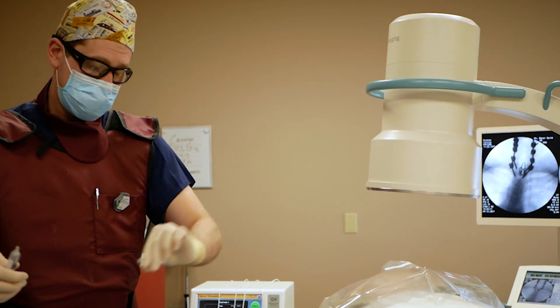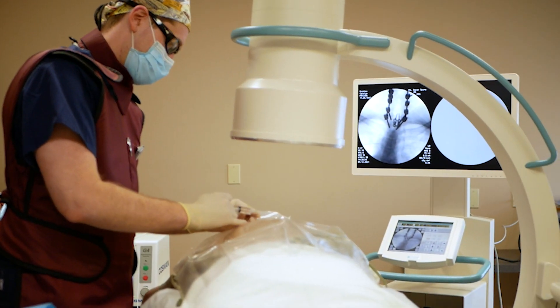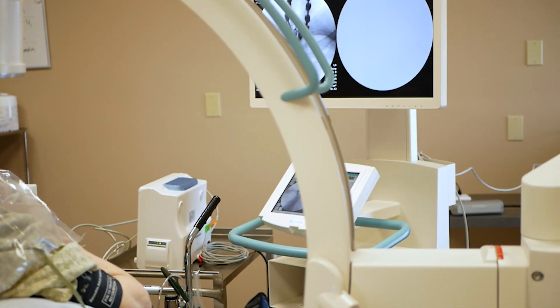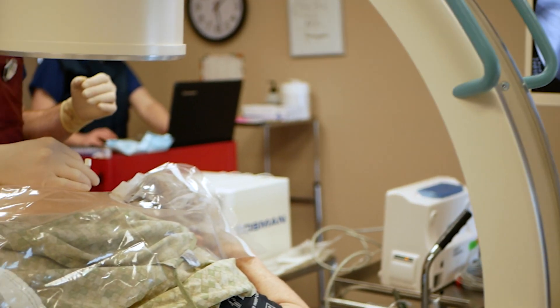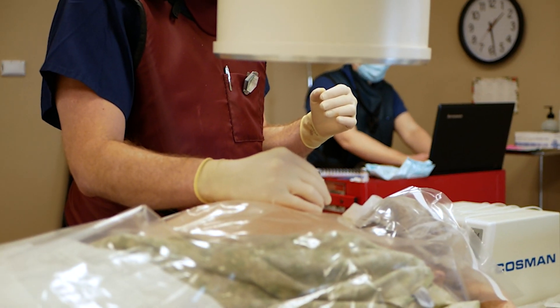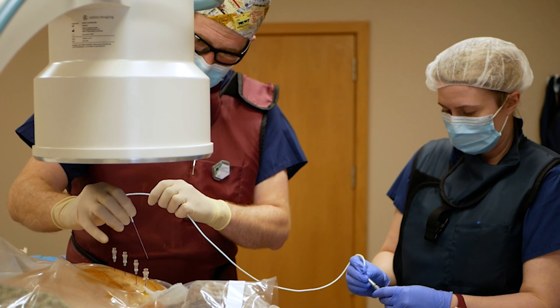During a radiofrequency ablation we usually use some sort of sedation to make you comfortable. Once we have you positioned and have decided whether x-ray or ultrasound guidance is appropriate, we clean the area of the body to sterilize the skin and minimize the risk of infection. We then obtain the proper images needed through x-ray or ultrasound, and numb the skin to make placement of the radiofrequency ablation probes painless.